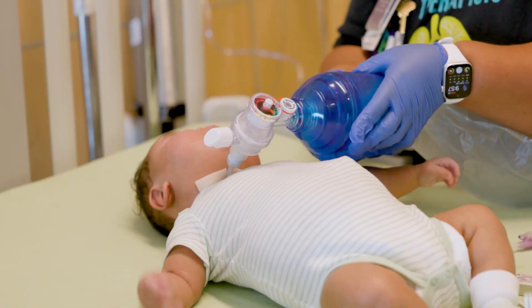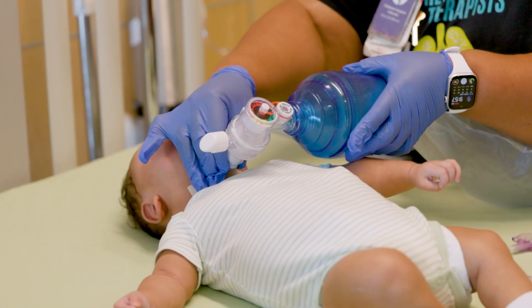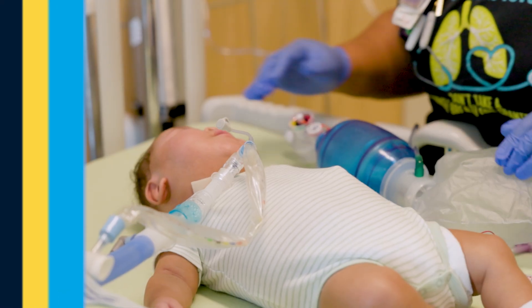When your child has improved and rescue breaths are no longer needed, remove the self-inflating bag from their trach. If your child is on a ventilator, reconnect the circuit.